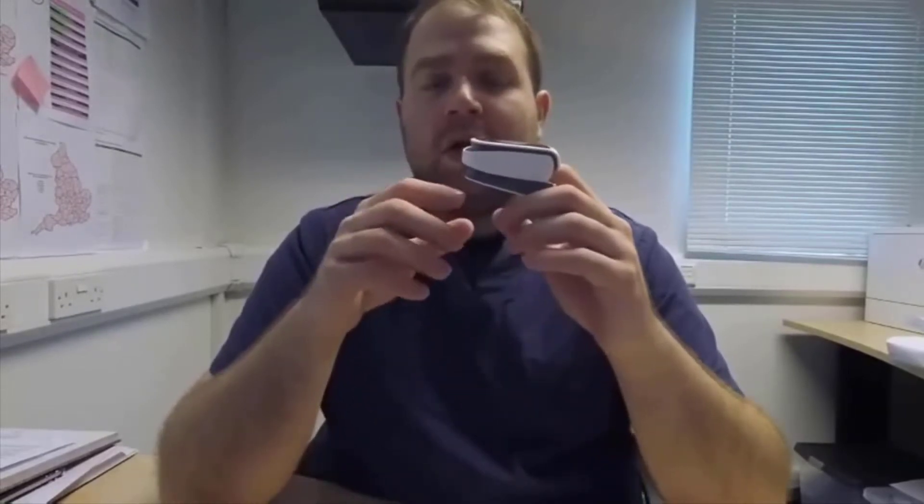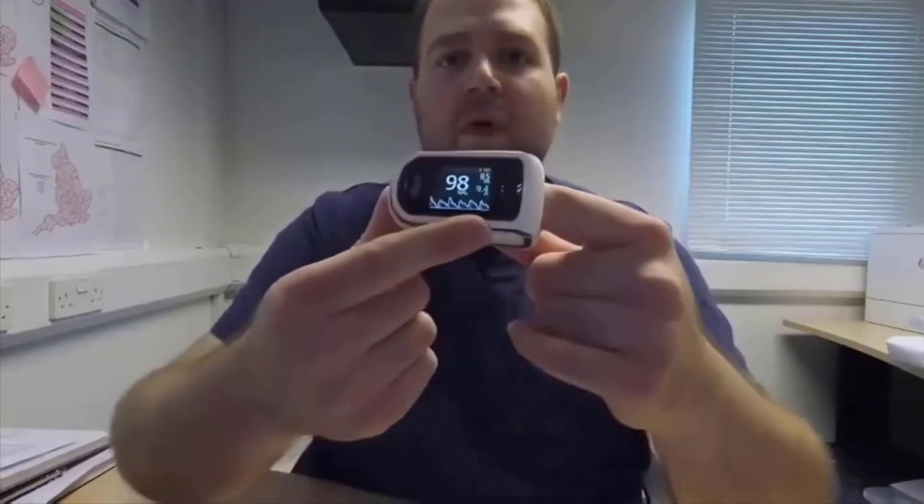It sits pretty comfortably on my finger. I've done two very long tests — six hours the first time and seven hours the second time of continuous measurement — and it never squeezed my finger; it always felt very comfortable. It also has these little movements on the back so that it doesn't squeeze your finger, or in our case the animal's tongue.